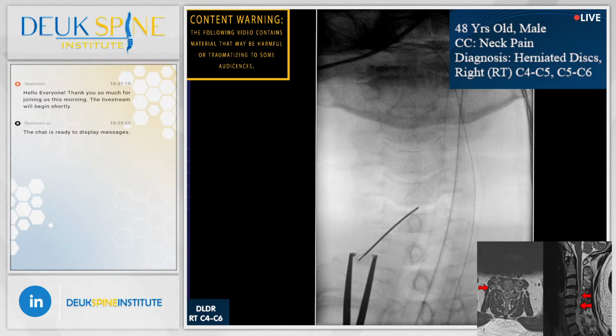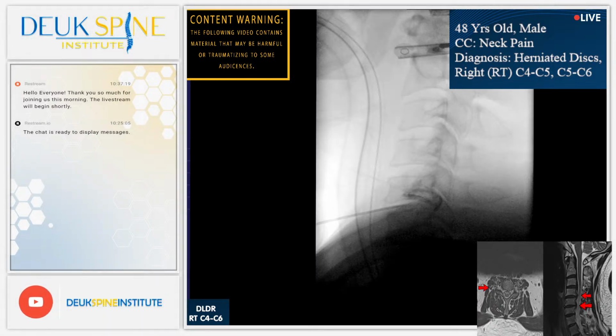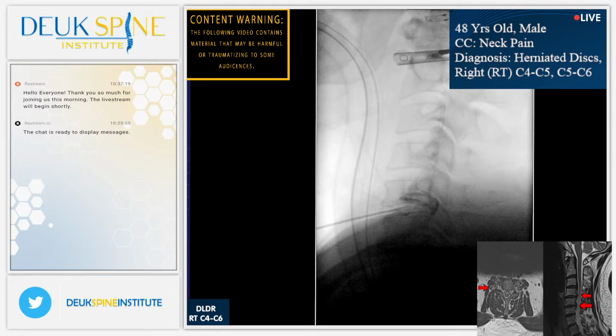Now the patient's asleep, so this is not an evocative discogram, it's a chromodiscogram. Basically checking to see if there's a tear, which there will be. Shot. There it is. You guys see the tear there? Jordan, one more. Show us the tear. Yes, we do. There it is.